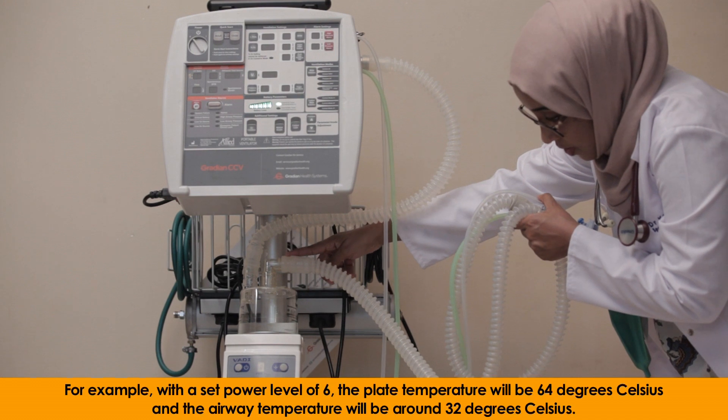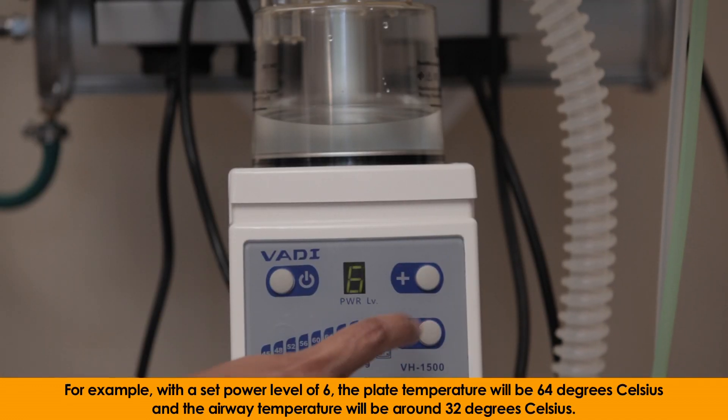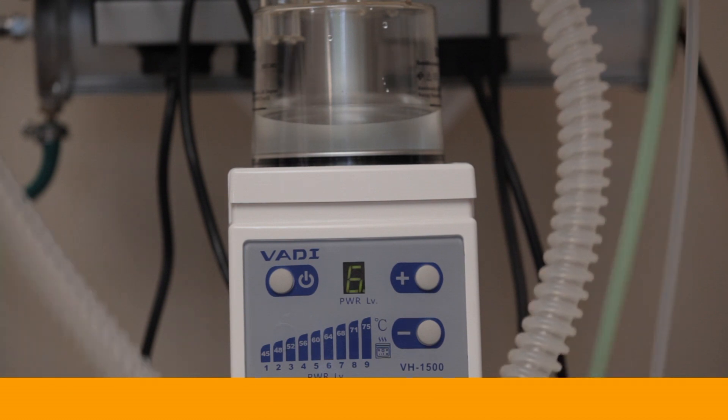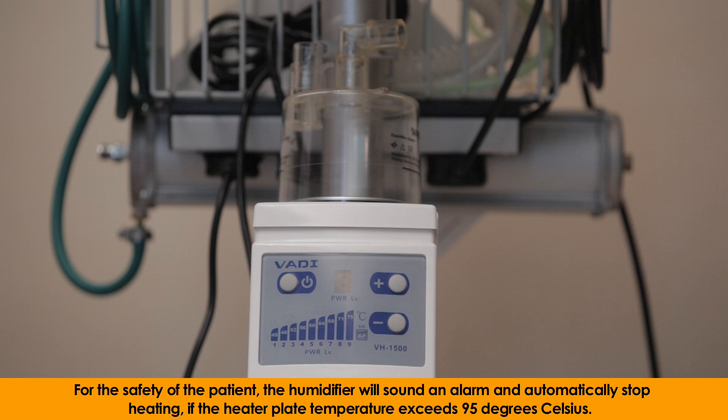For example, with a set power level of 6, the plate temperature will be 64 degrees Celsius, and the airway temperature will be around 32 degrees Celsius. For the safety of the patient, the humidifier will sound an alarm and automatically stop heating if the heater plate temperature exceeds 95 degrees Celsius.